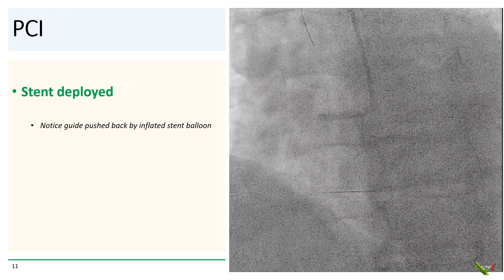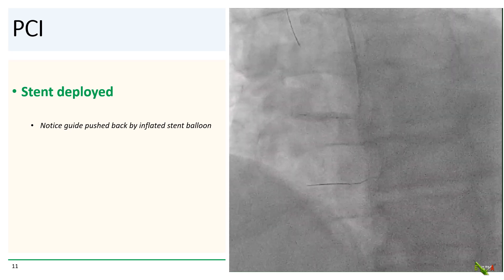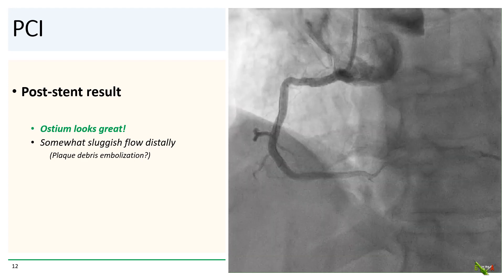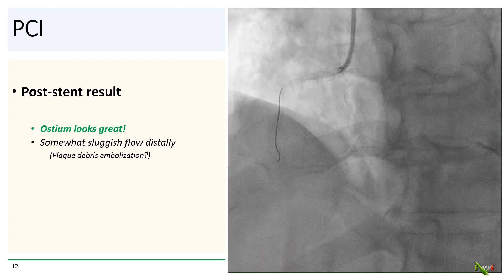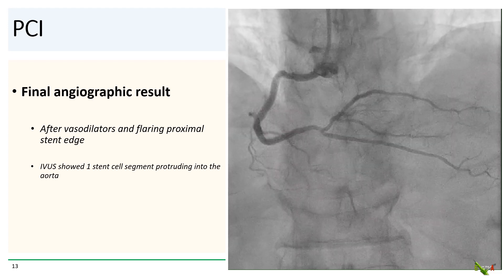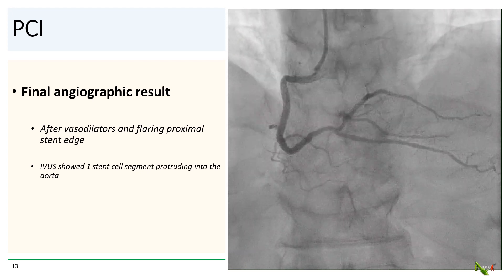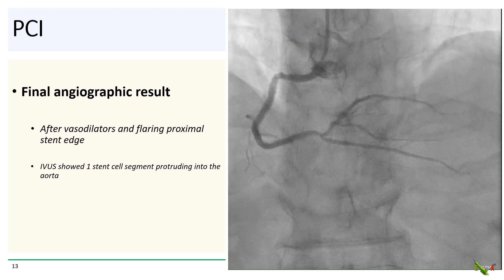We went ahead and deployed the stent, and notice that as the stent balloon goes up, the guide will be pushed back by the inflated stent balloon. Here is the immediate post-stent result. The ostium looks great, but the flow distally is somewhat sluggish, maybe from embolization of plaque debris. We gave some vasodilators and flared the proximal stent edge, and here's the final angiographic result, which we thought looked quite good. IVUS showed one stent cell segment protruding into the aorta, which is exactly what we were hoping to achieve.